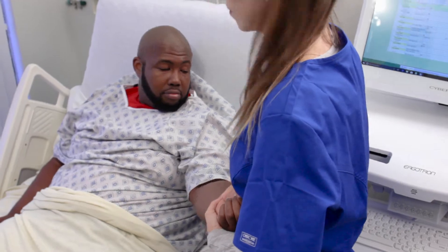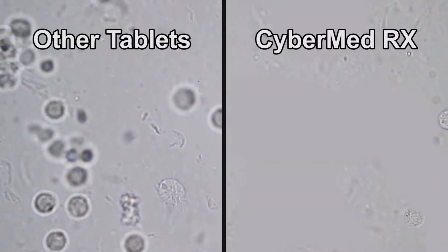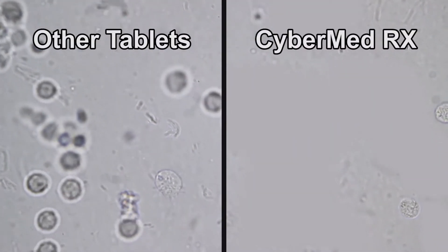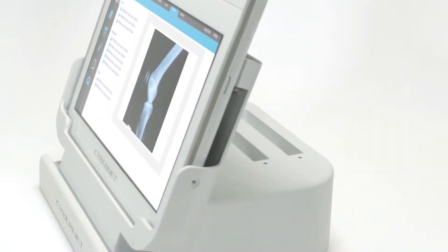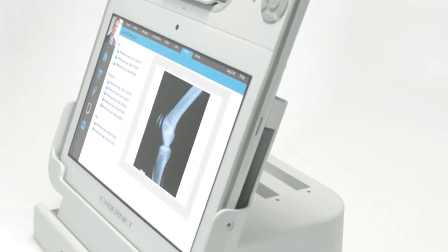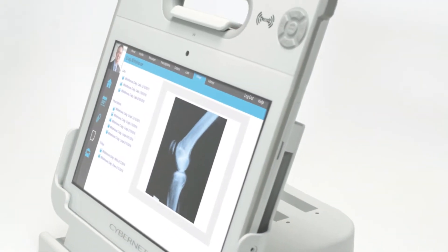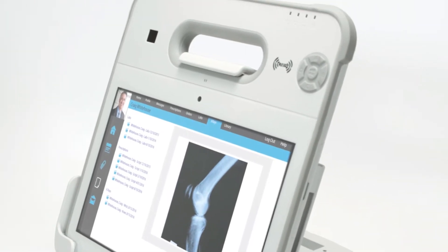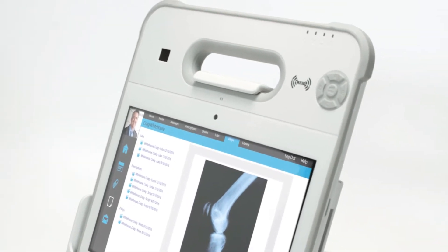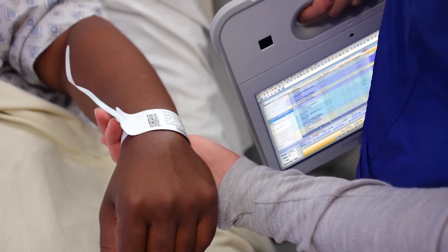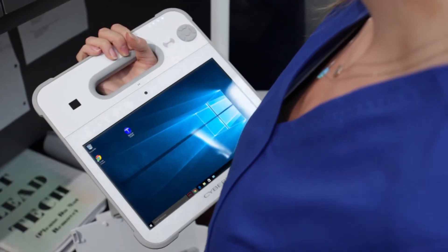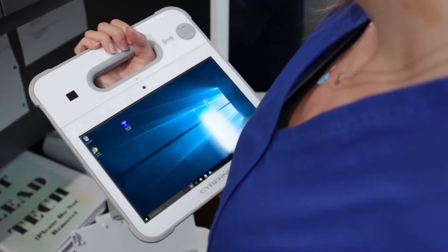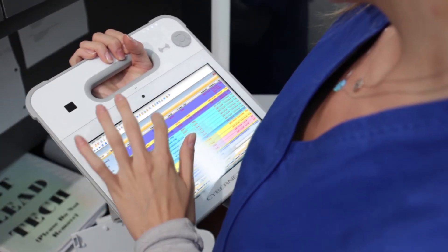It's IP65 certified for water and foreign object protection, features a capacitive touch screen, a barcode scanner, built-in RFID technology, and is Imprivata single sign-on certified to help keep your patient information safe, secure, and in the right hands.